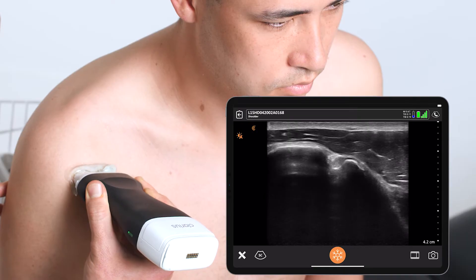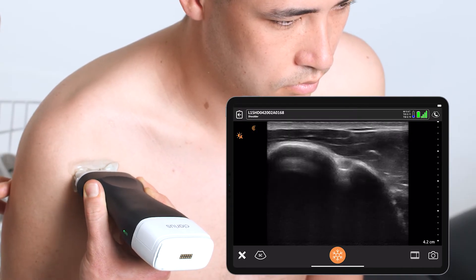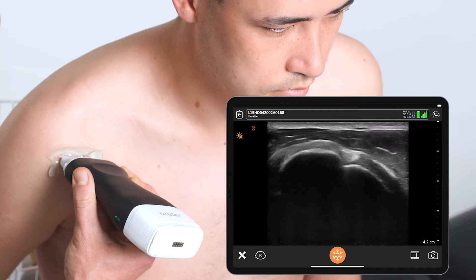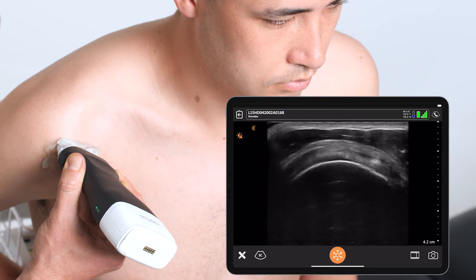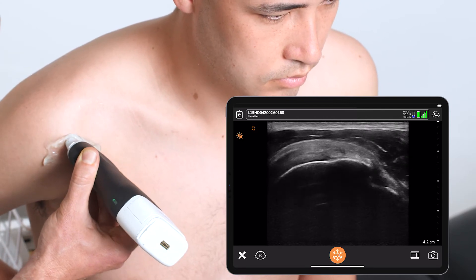First I'm going to identify the biceps tendon and look for any joint effusions as black fluid right adjacent to the humeral head itself. From here, I like to bring the patient's arm behind their back to bring out the supraspinatus tendon and the rotator cuff interval attached to the bicep tendon seen here.